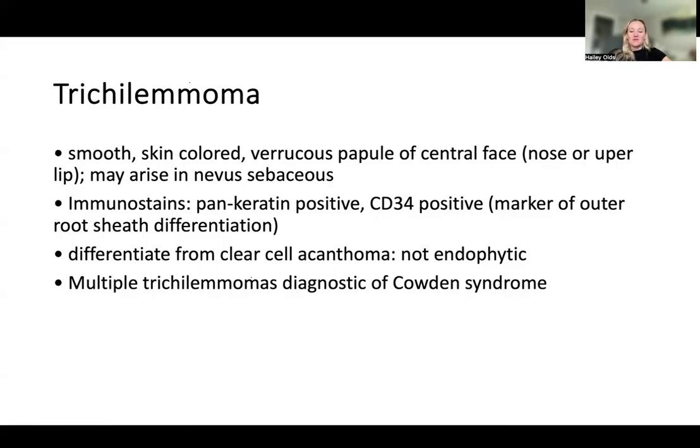And then in terms of immunostains, they're pan-keratin positive and CD34 positive, which marks outer root sheath differentiation. And the difference from clear cell acanthoma is that it's not endophytic.